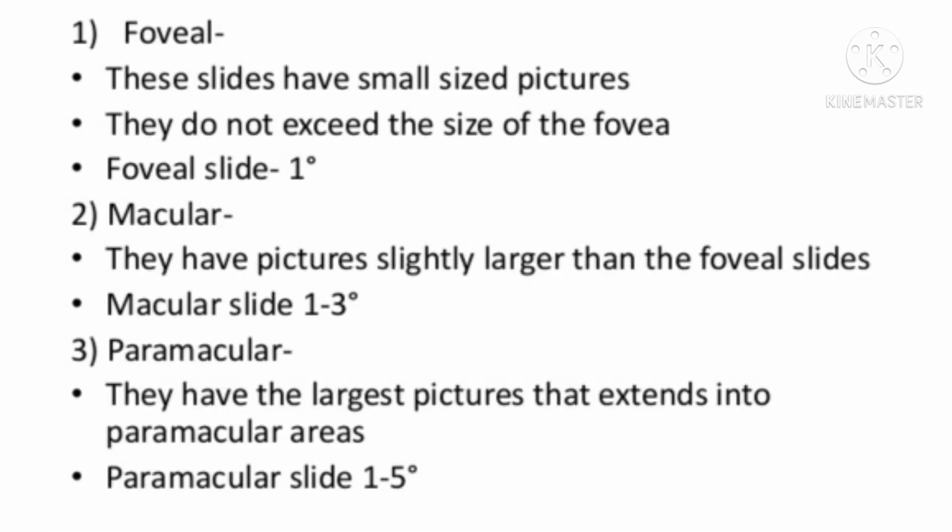Foveal: these slides have small sized pictures. They do not exceed the size of fovea. And this foveal slide is one degree angle at the nodal point of eye.